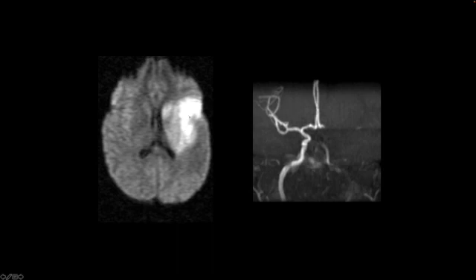So here's an MRI diffusion sequence that shows restricted diffusion in the geographic area involving that MCA vascular distribution. And here's an image from the MRA that shows that the middle cerebral artery on the left side shows no flow-related enhancement, where the right side looks normal.